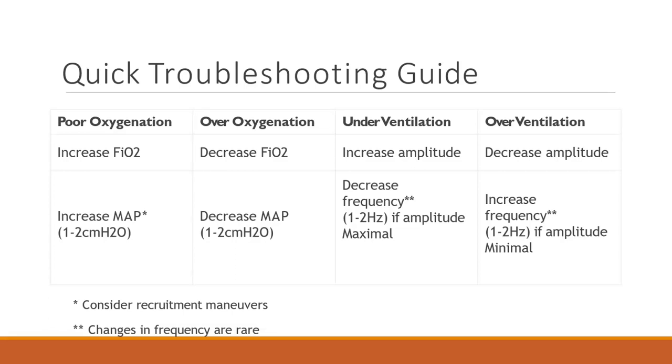Ventilation, increase the amplitude, which we do by the power, okay? And then again, decrease the amplitude. The frequency in the hertz is what makes everybody crazy, because it's inverse and it's hard to understand. Know that it's almost never done. That's why I'm kind of skipping over it. I'll show it to you on one slide, but it's just a lot.